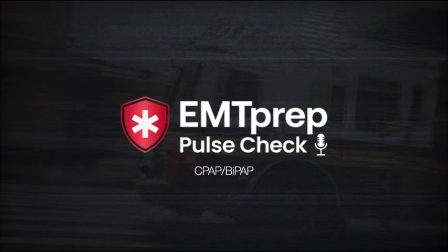The next question, or question 4, is the main therapeutic benefit of using CPAP or BiPAP is to do what? A, prevent the patient from going into respiratory arrest by improving oxygenation and ventilation efforts through non-invasive positive pressure ventilation. B, prevent the patient from going into cardiac arrest by improving perfusion. C, prevent the patient from going into respiratory distress by improving oxygenation and ventilation efforts through non-invasive positive pressure ventilation. Or D, prevent the patient from going into respiratory arrest by deteriorating oxygenation and ventilation efforts through non-invasive positive pressure ventilation.